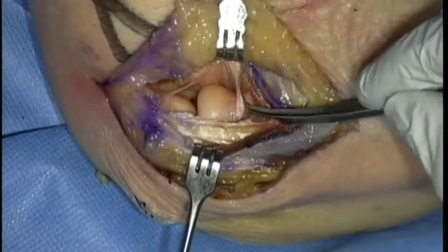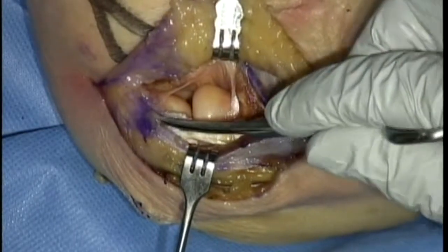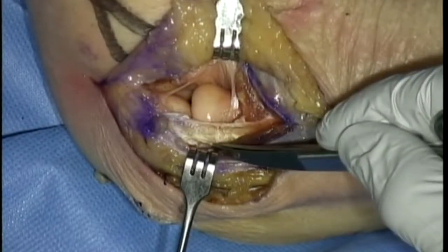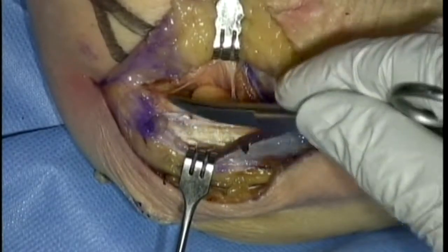So that's nice with the Kaplan. You can see that very nicely if you need to repair it. Suture anchors there. Or you can get into the elbow joint without detaching. You can come anterior to it without destabilizing the elbow.